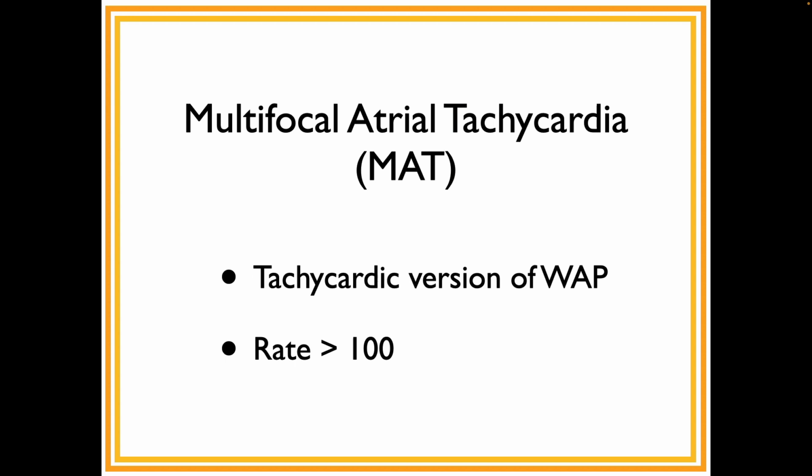Okay, almost done here. Multifocal atrial tach, also called MAT, is just wandering atrial pacemaker that's faster than 100. Okay?